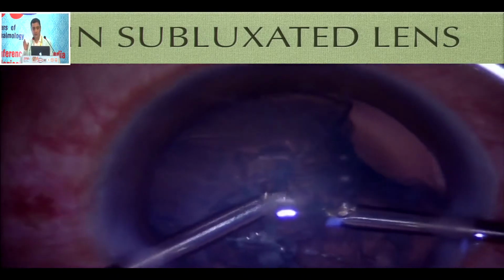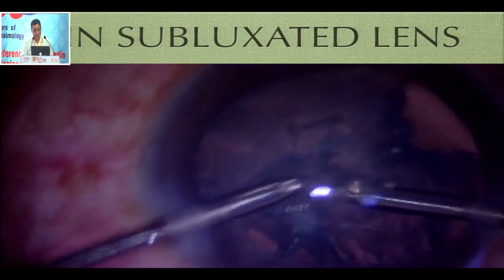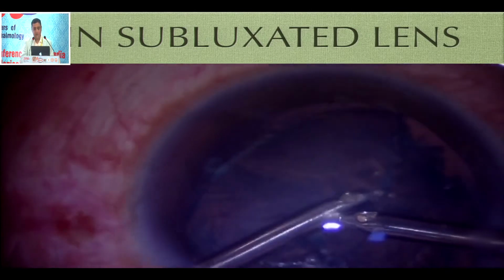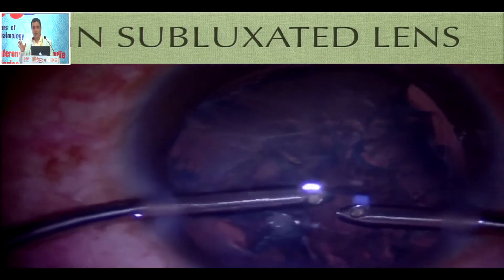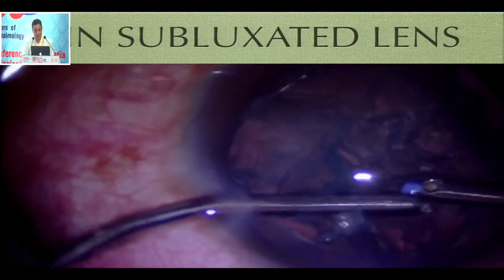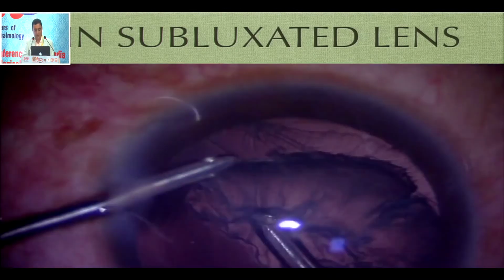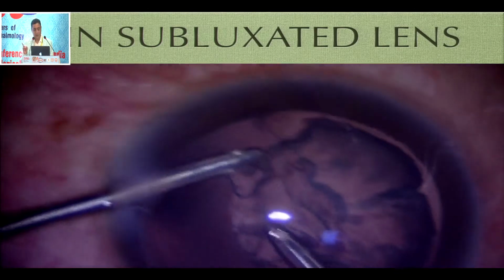Look at the posterior capsule, don't look at the anterior capsule throughout the procedure, and see how it behaves. One more take-home message from this presentation will be that the IOL always centers in the center of the bag, irrespective of where you do your rhexis. So whatever you do, even if you do your rhexis on the visual axis, center of the limbus, whatever you say, now just look at the behavior of the posterior capsule here and the rest of the bag.